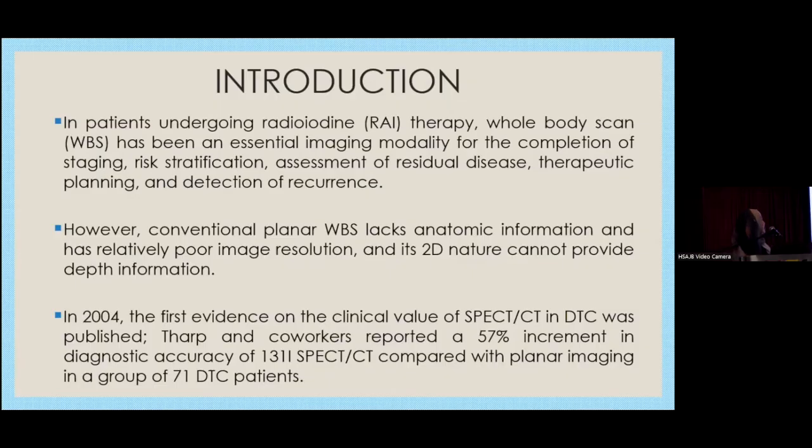So now I come to the topic: why we need a SPECT-CT. Introduction: in patients undergoing radioiodine, whole body scan has been an essential imaging modality for the completion of staging, risk stratification, assessment of residual disease, therapeutic planning, as well as to detect recurrence. However, we know that planar WBS, whole body scan, is 2D in nature, so it cannot provide depth information about the disease, and there is lack or poor anatomic information because of the poor image resolution.